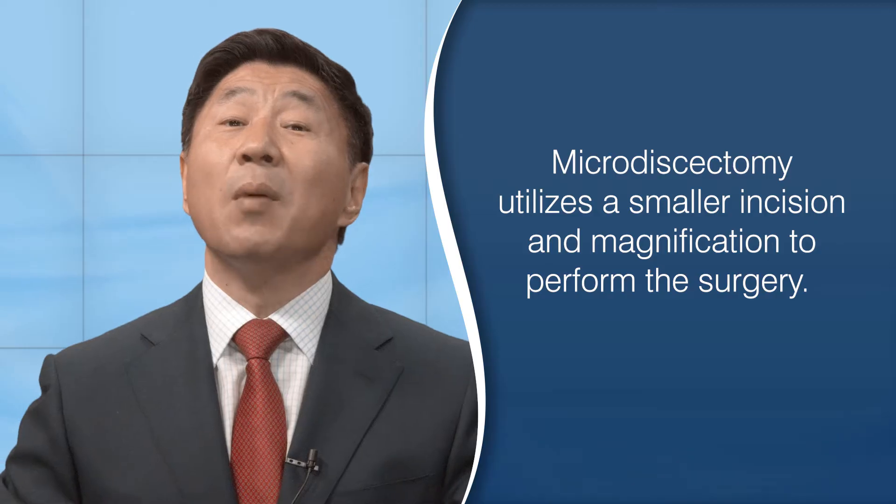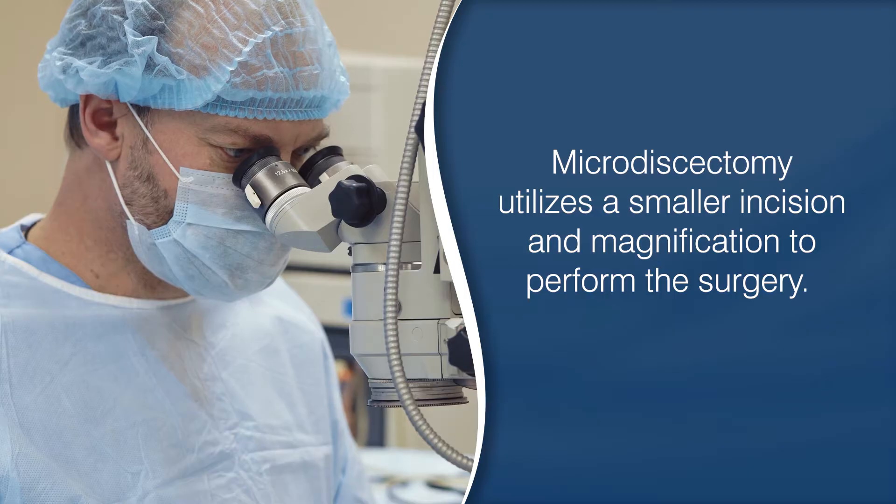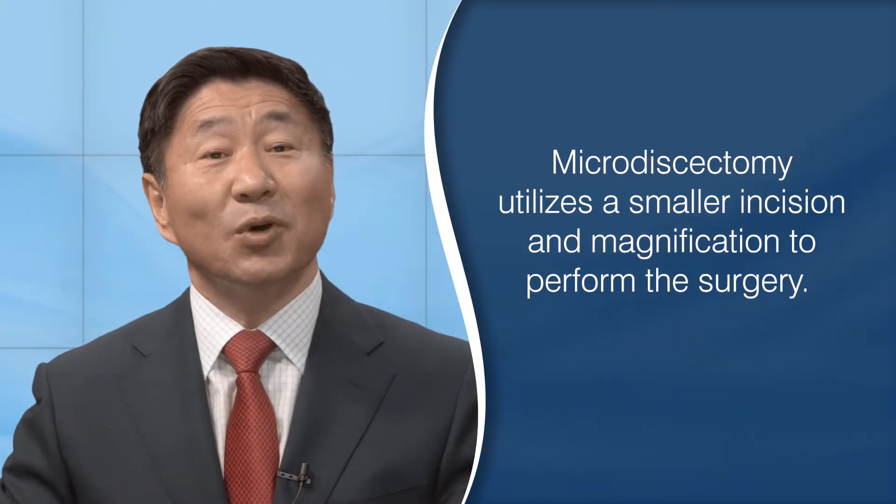The term microdiscectomy can also describe the smaller incisions utilized with magnification. Microdiscectomy is the standard in most communities.